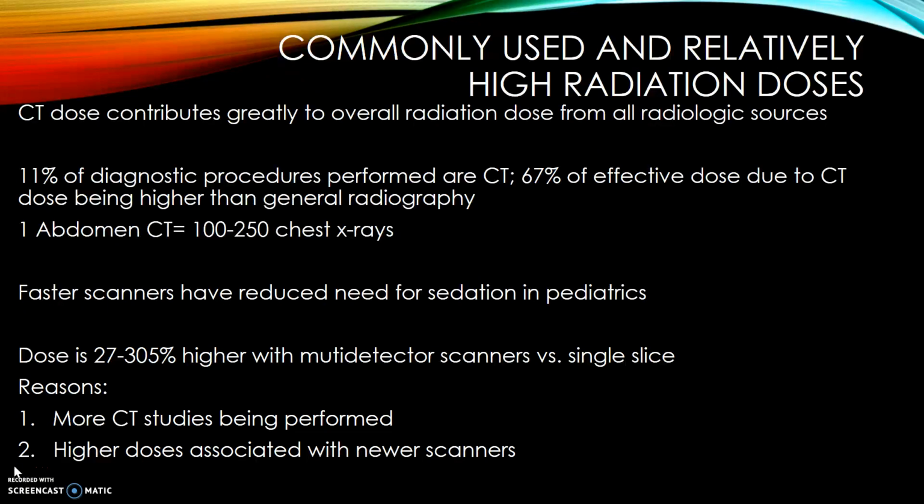CT dose contributes greatly to overall radiation dose from all radiologic sources. 11% of diagnostic procedures performed are CT. 67% of effective dose is due to CT, with CT dose being higher than general radiography. One abdomen CT equals about 100 to 250 chest x-rays.